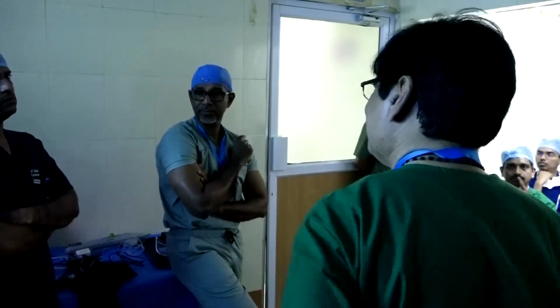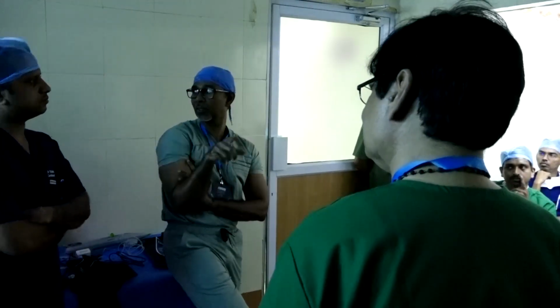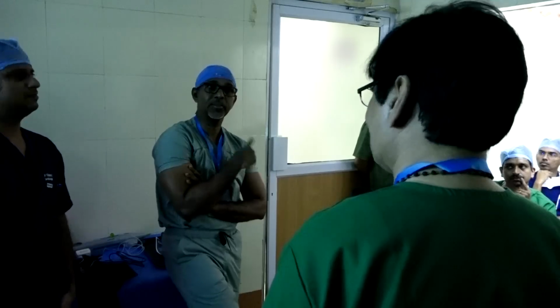I think the TPA might be put that. Okay, sure.